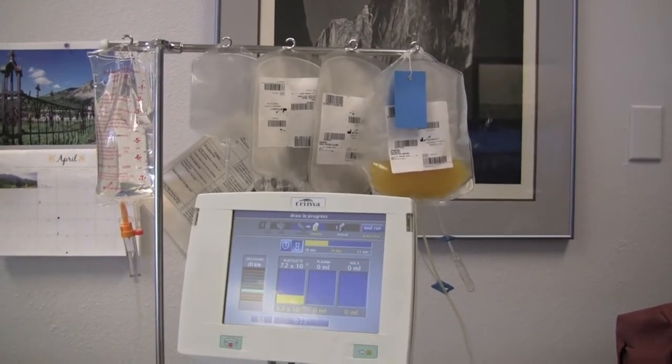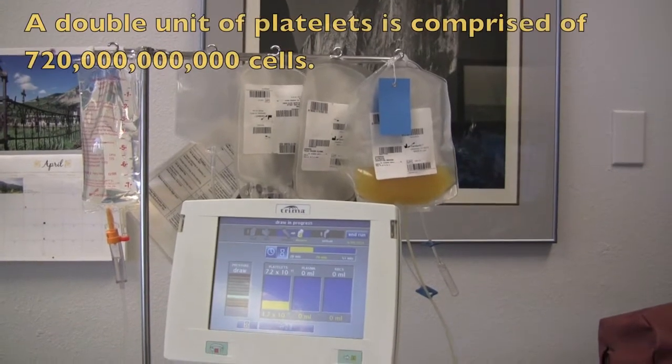The yellowish colored liquid is Daniel's platelets being collected.